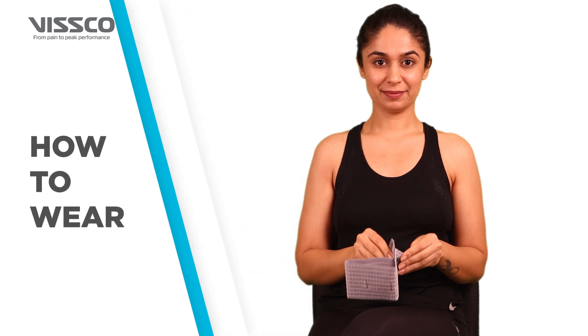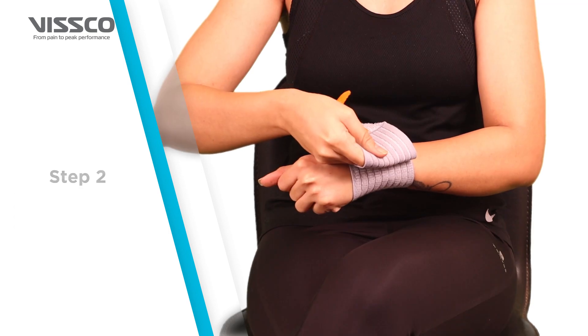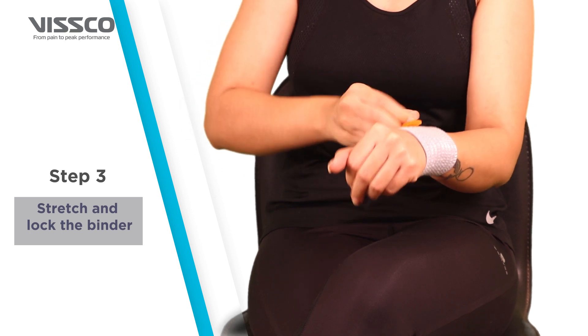Now let's wear the product. First, open the binder and simply wrap it around the wrist. Stretch and lock the binder with the help of Velcro.